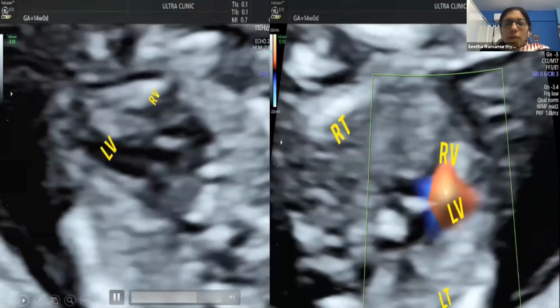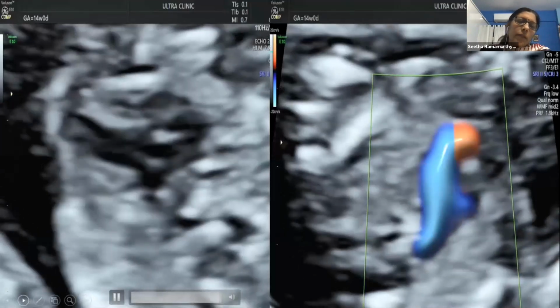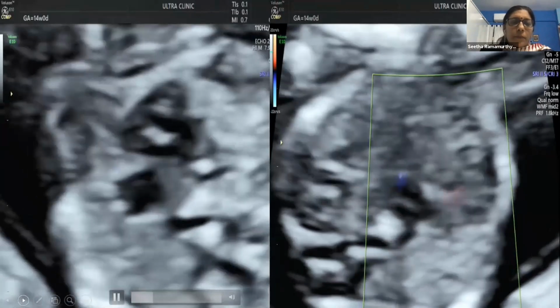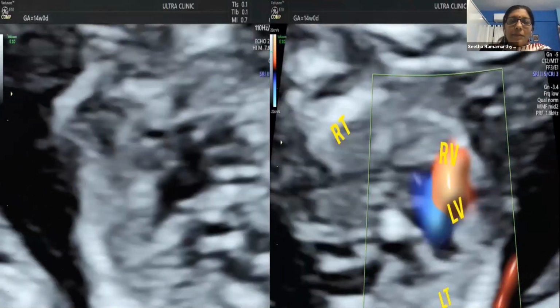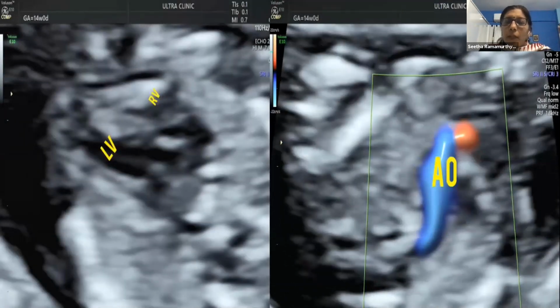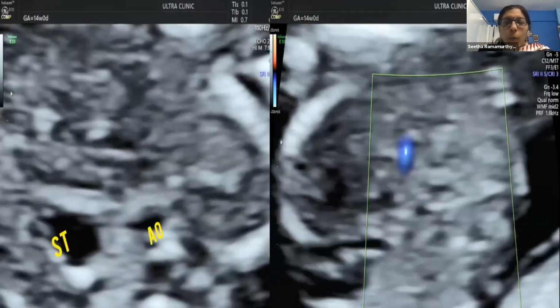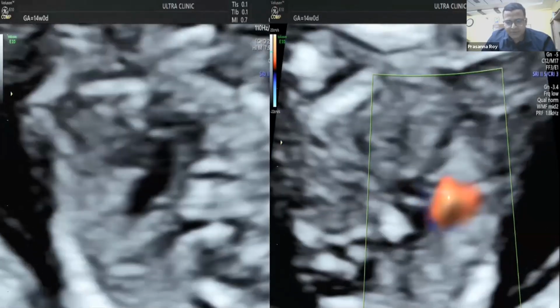Okay. So basically, again, this is an abnormal 4-chamber heart with the right side of the heart being the reversal of the typical finding, the mirror image of the left. The maldevelopment, so the right side looks very underdeveloped with the 4-chamber color view. Is there any flow across the tricuspid valve? No, ma'am. And there is a small VSD here.